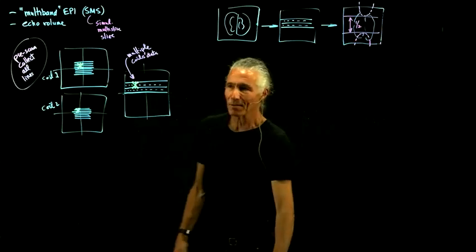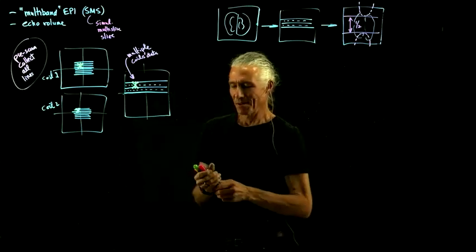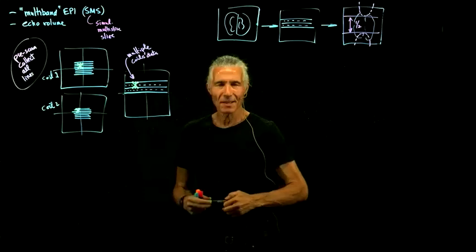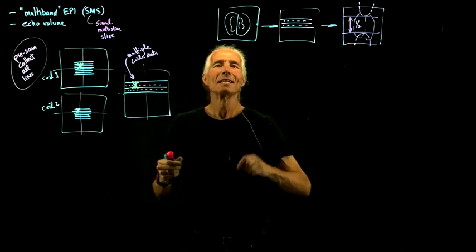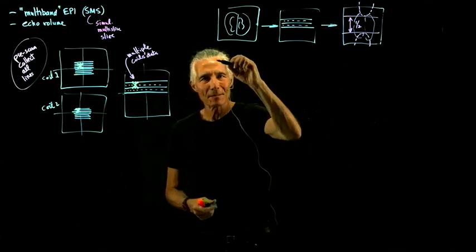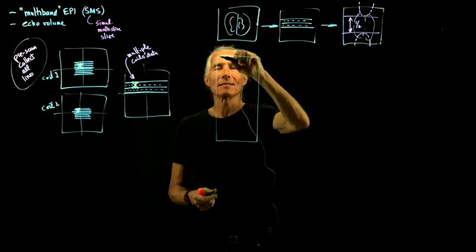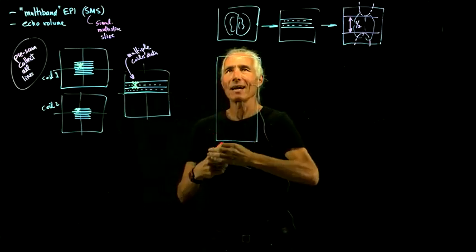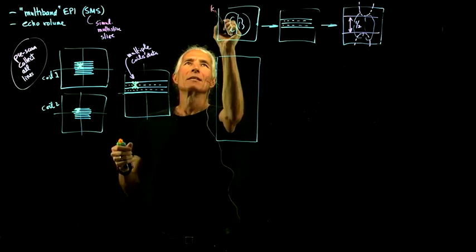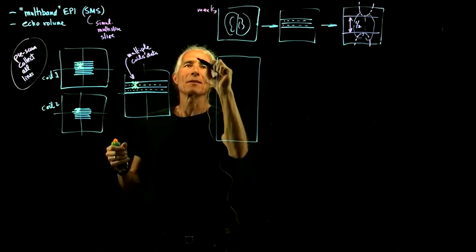So now let's look at what we did for the multiband. So in the multiband, it's kind of as if we, I'll draw a rectangular k-space, but that's not quite right. You should think of it as it's going up to the same kx. So this is the same ky. So here's ky, max ky, and that's the same here.